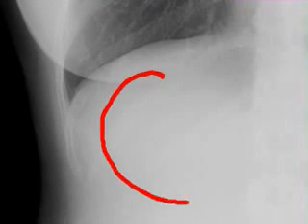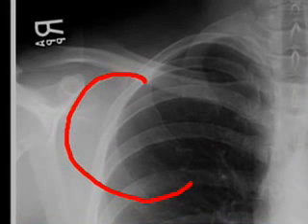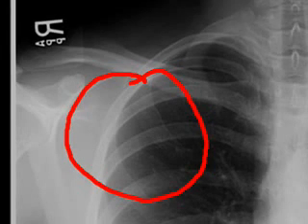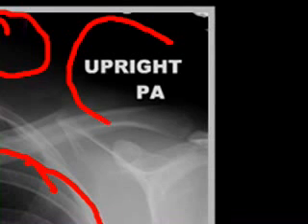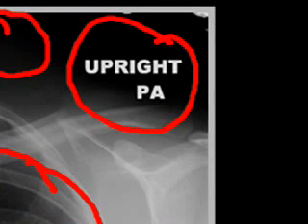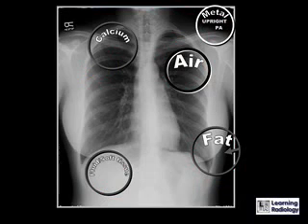We can see fluid or soft tissue density in the right upper quadrant of the abdomen with the liver. We see bone or calcium density in the clavicle, scapula, and ribs. There is also metal density in the marker that the technologist places on the film to indicate this is an upright PA film. So these are all five of the radiographic densities visible on a chest x-ray.